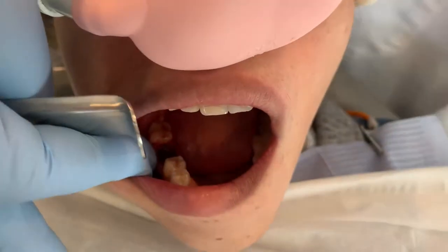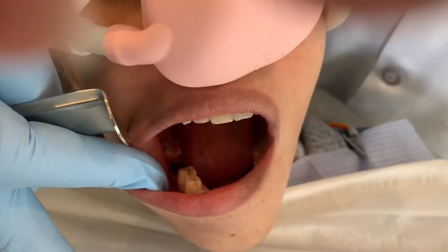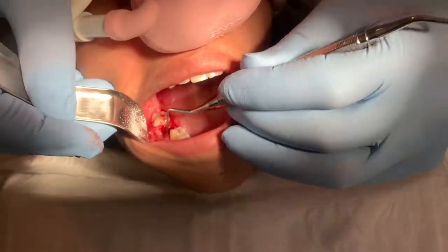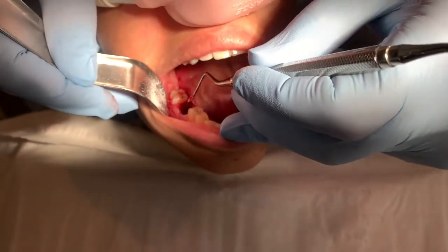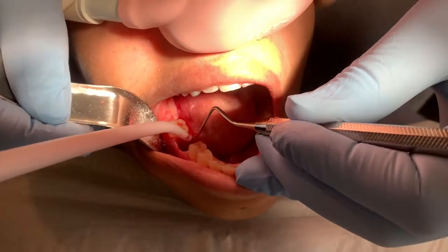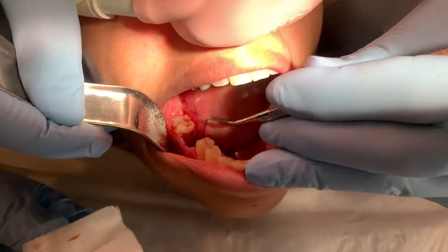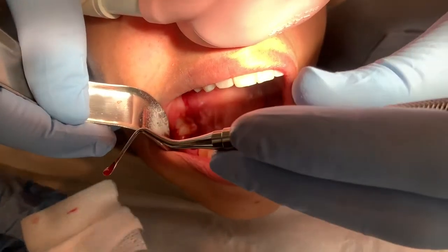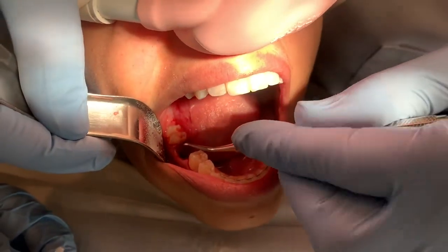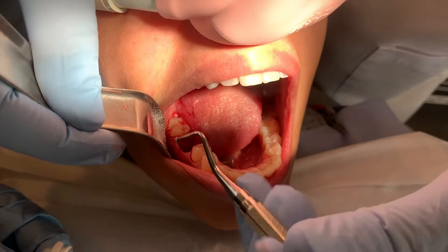So the first thing we're going to do is remove the periodontal ligament, which I do with this curette instrument. Sometimes there's the need for some strategies that are a little more aggressive, but this is a tooth that's really fairly easy to clean. You're not going to be able to hear as much now because I'm going to turn the suction on. Go ahead and suction in here. Just going to get this instrument down here and really clean. You can see that these are the little fibers. You can go ahead and suction that away, that's fine. Get down in this site. You really want to make sure to get down to the bottom. Get it all clean.